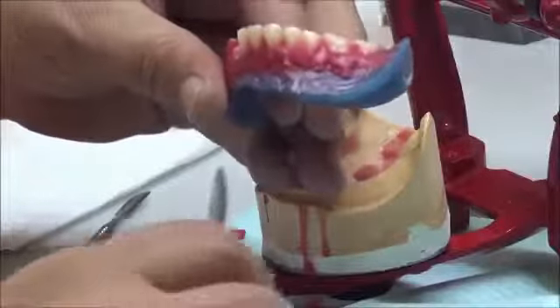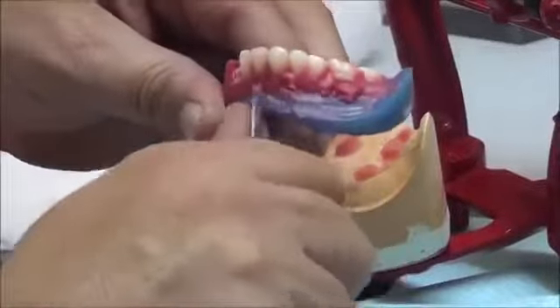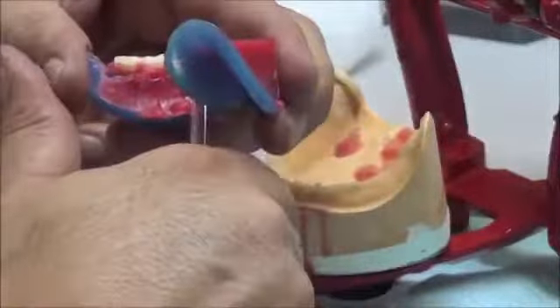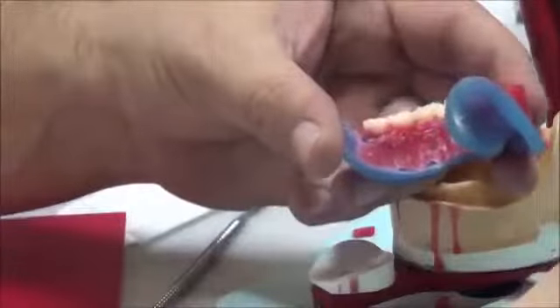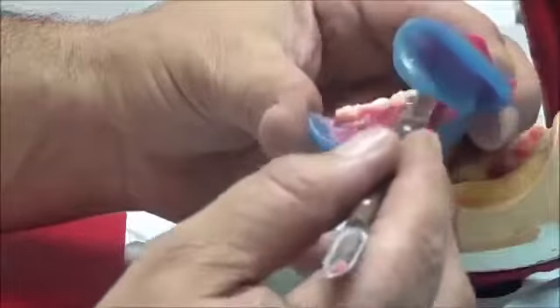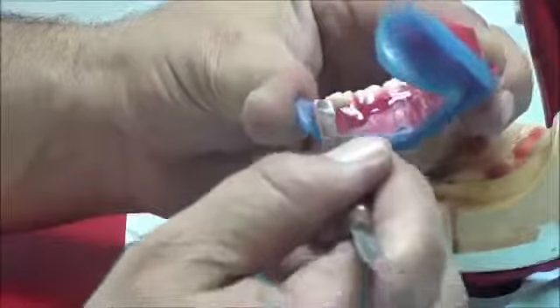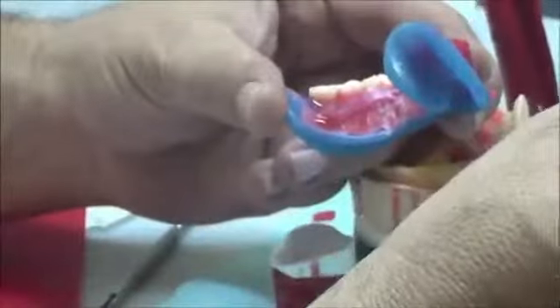So now we're going to begin the cleaning of the wax. Make sure that the fitting surface and the sulcus are totally clean. The sulcus should be totally clean from any wax. And once we finalize the wax on both sides, we are now ready to do a step called wax up or festooning, which is adding wax to mimic the gingival tissue around the teeth.